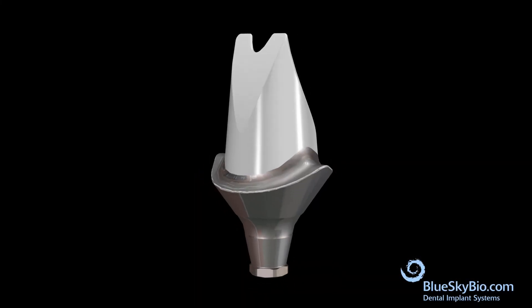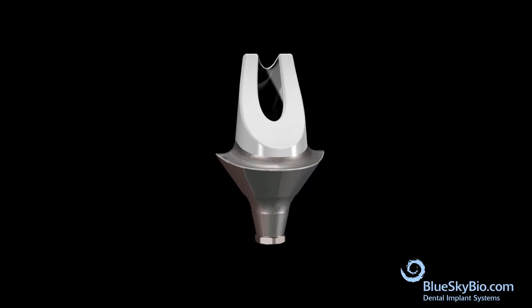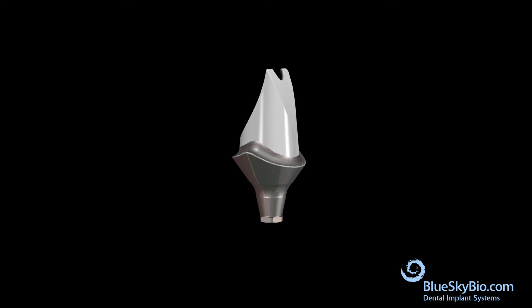This video shows how to make a custom abutment from a preformed blank and opaque with white metal for improved aesthetics.